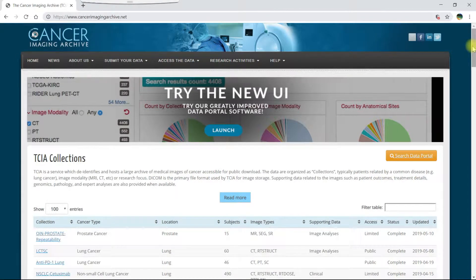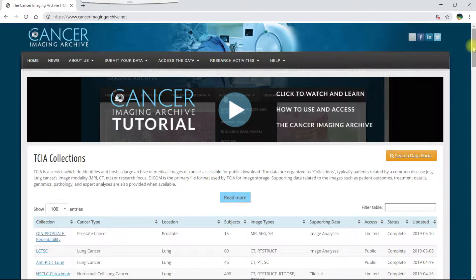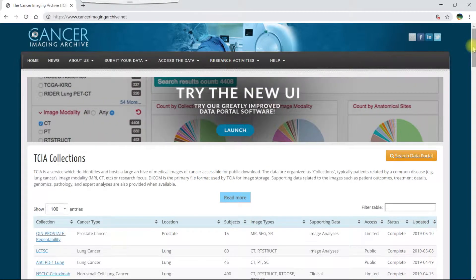Welcome to this video tutorial that explains how to use the data cart in the TCIA data portal. Let's start on the TCIA homepage at cancerimagingarchive.net.